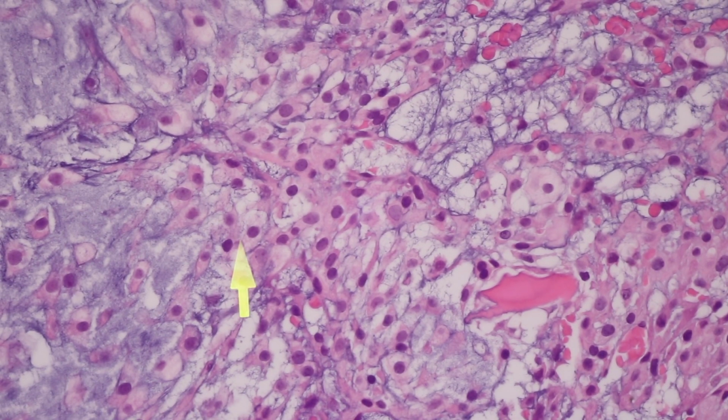One thing I've noticed over time is that sometimes in reactive cartilage, like at fracture sites, the chondrocytes get quite large and have pale open chromatin, and I've always found that to be a challenging difficulty. Yes, so if you just take the chondrocyte out of cellular callus and just look at that, there is morphologic identity with the nuclei of the cartilage. And it can be very difficult.